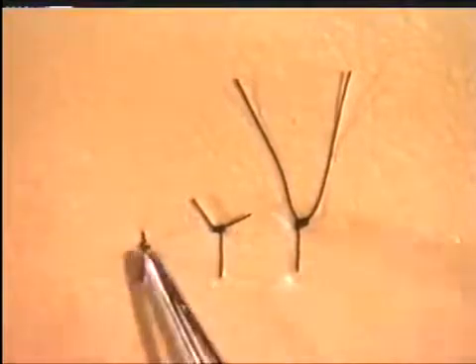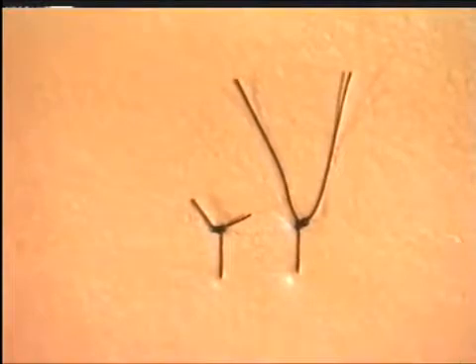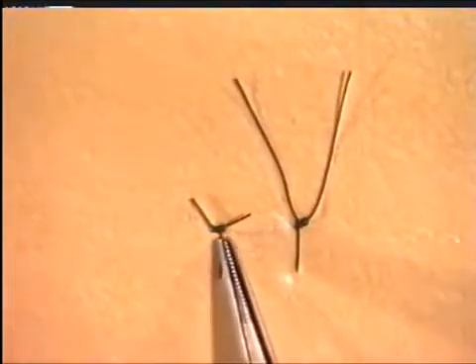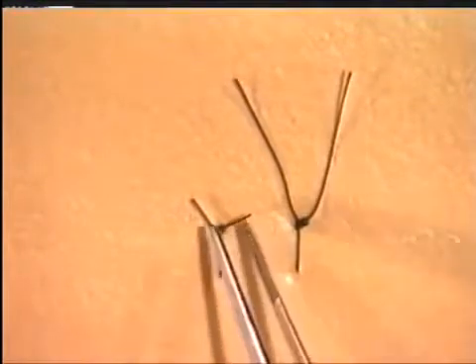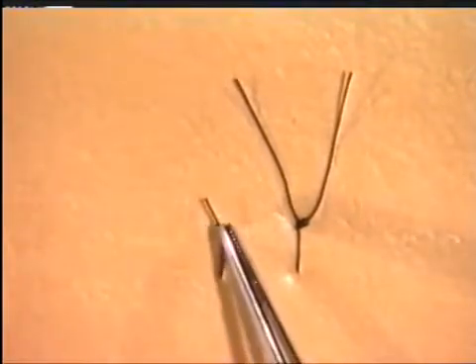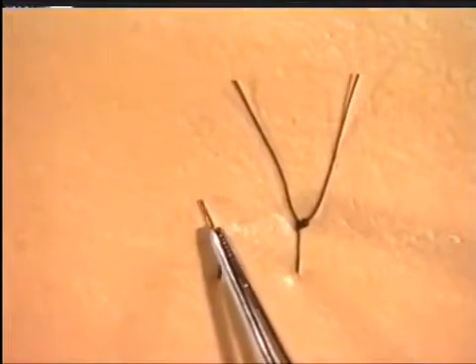However, don't cut them too short, otherwise this will be insecure and might even lead to the unraveling of the knot. Cut the suture to such a length that it will be secure and also allow the suture to be grasped during its subsequent removal.